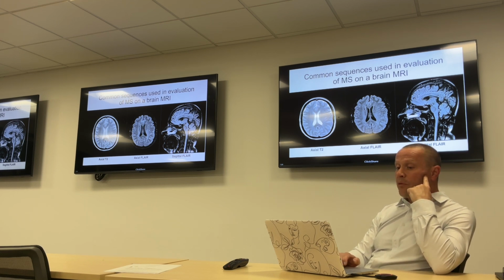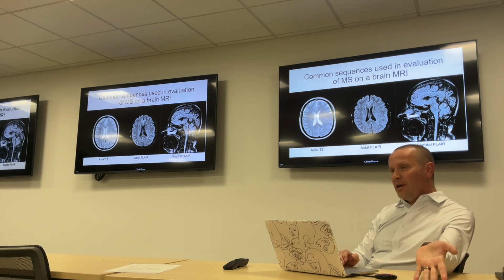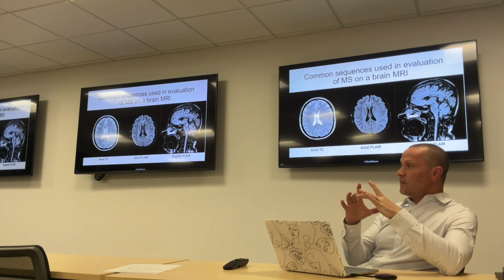When I'm looking at a brain, the first thing I do pretty much when I look at a brain MRI is try to decide, without looking at the history right away, how old this patient is. The way I do that is I compare the amount of brain tissue to the amount of fluid inside and surrounding the brain. The skull is a very fixed volume, right?